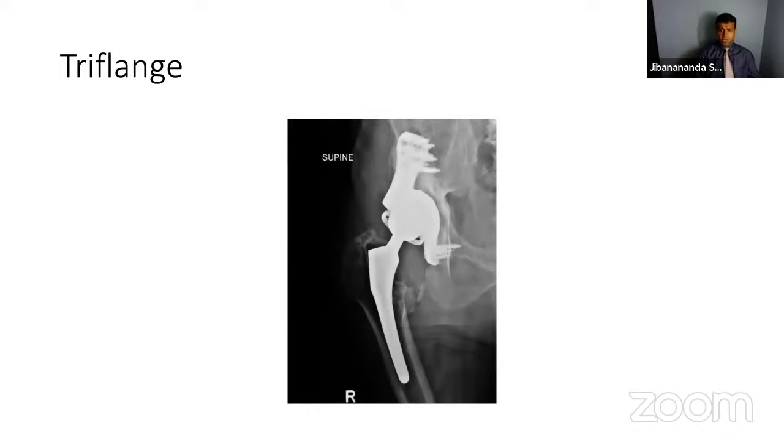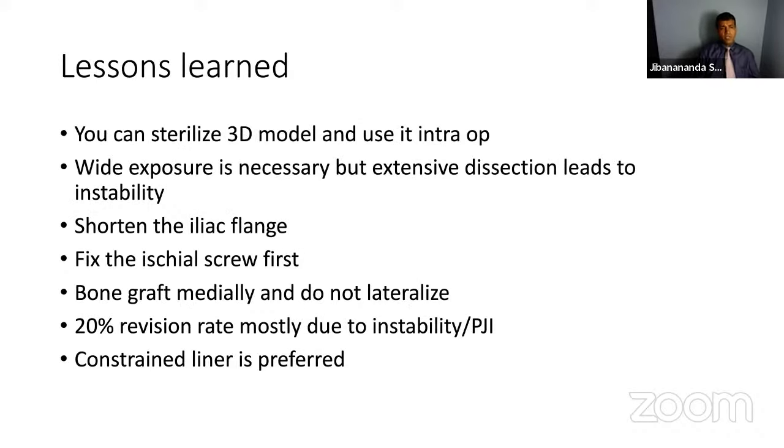This patient is doing well at 8 months at this time. Lessons learned: you can sterilize a 3D model. You can put it intra-op. It's actually a very useful way, pretty much, to navigate when you're operating.